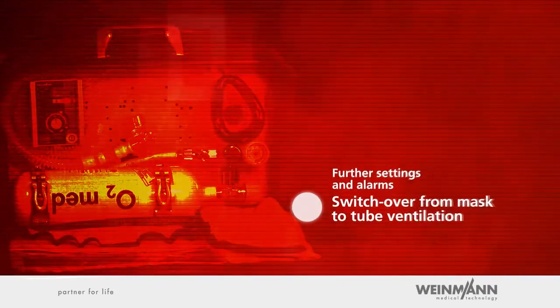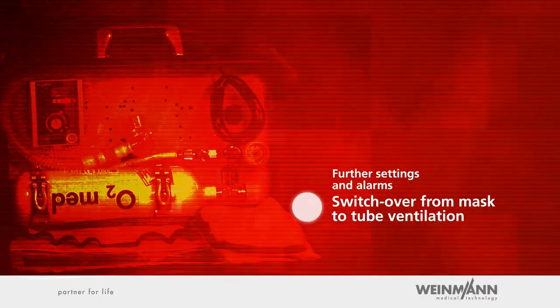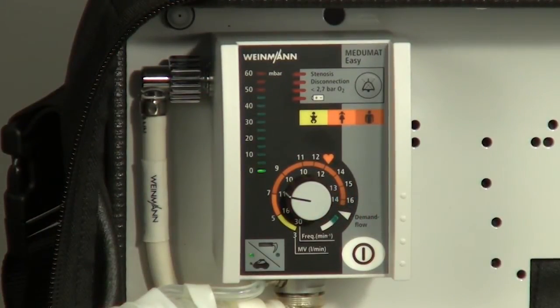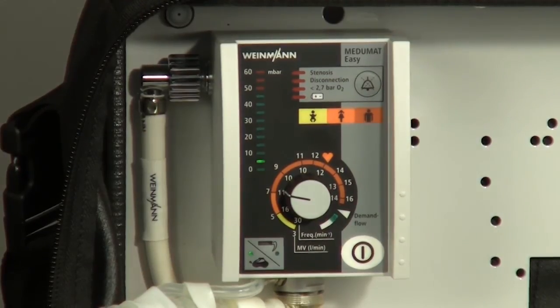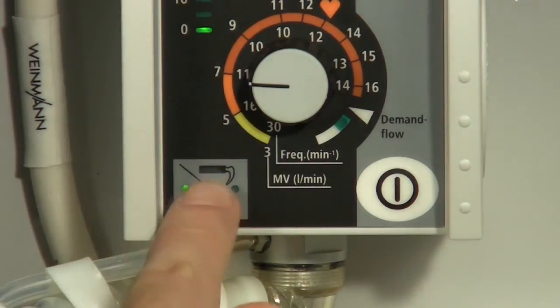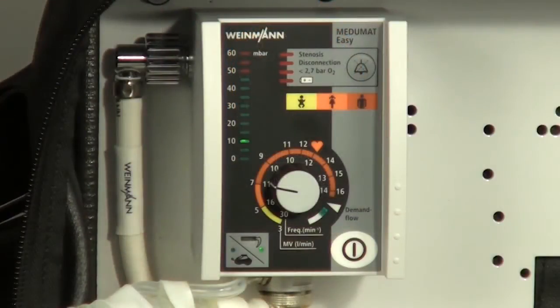Further settings and alarms — switch over from mask to tube ventilation. In certain situations, it makes sense to allow higher airway pressure during ventilation. By pressing the key in the middle of the mask-tube ventilation switch, you can increase the ventilation pressure limit from 20 millibar to 45 millibar. Mejumat Easy confirms the activation with a green LED next to the laryngoscope symbol and with the voice prompt: tube ventilation mode, ventilation pressure limit 45 millibar.